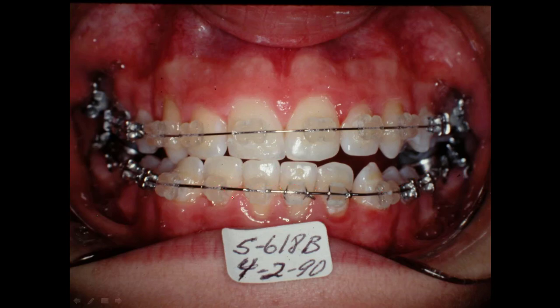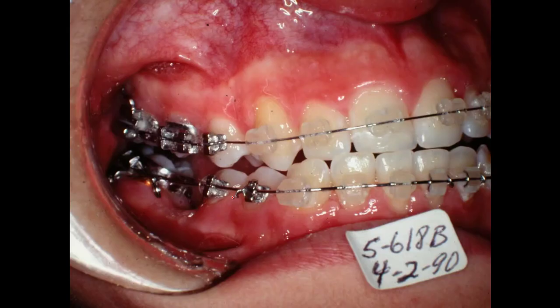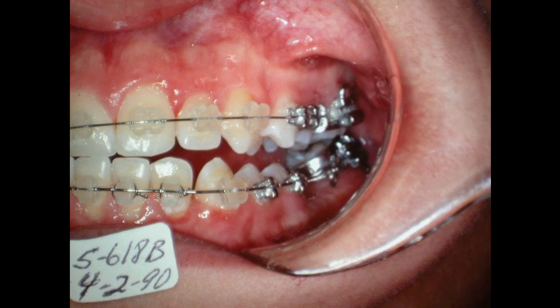Here, you take the teeth out when you've got the braces, brackets, and everything on the teeth ready to go. As we start bringing this forward, we're using a little loop that you activate — you put it in the molar tube over here and you're dragging the molar forward. It puts a lot of force on it so it brings the molar forward bodily.